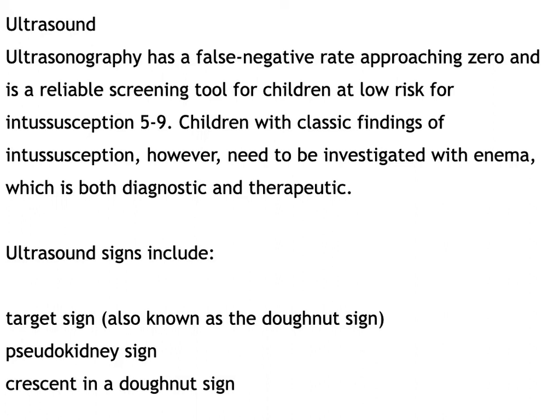Now, ultrasound signs include the target sign, also known as the donut sign, and the pseudo kidney sign. That is the transverse view. But in the sagittal view, it is similar to a sandwich. So remember the sign: target sign.